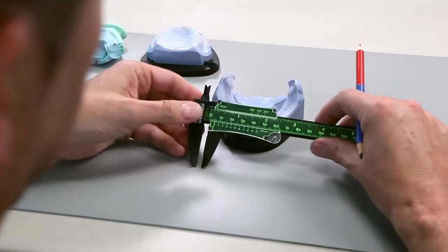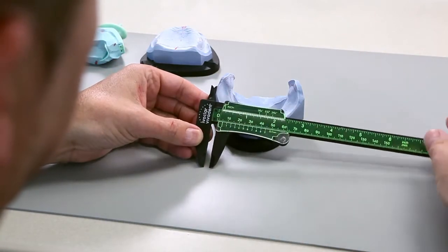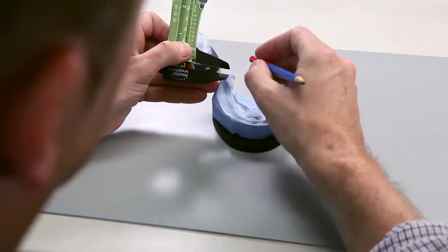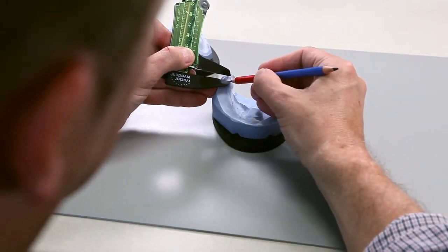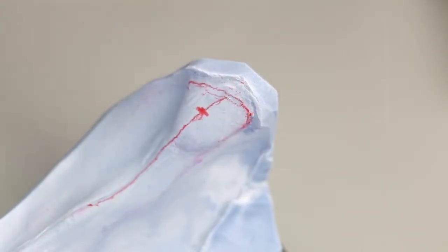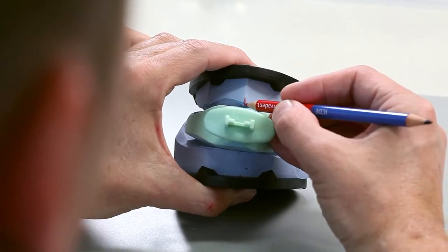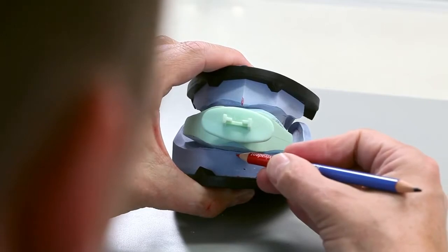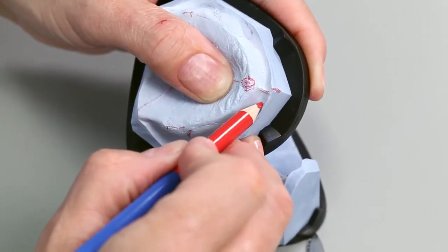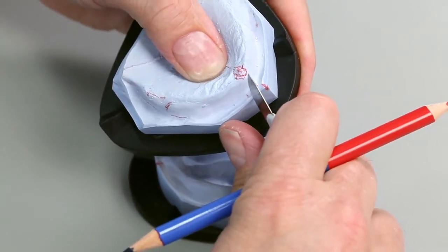For the alignment of the occlusal plane, bisect the two retromolar pads. Often, the whole pad cannot be identified clearly. However, experience has shown that the occlusal plane is situated approximately 5 mm below the dorsal end. Mark the extended anatomical midline in the upper jaw on the model edge and transfer it to the lower jaw. Mark the lowest point in the vestibule and trim the model edge up until this point.